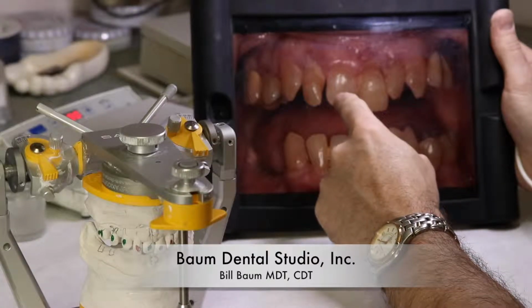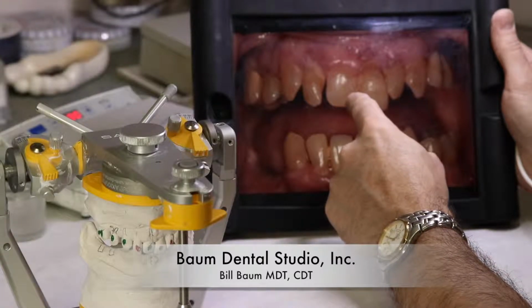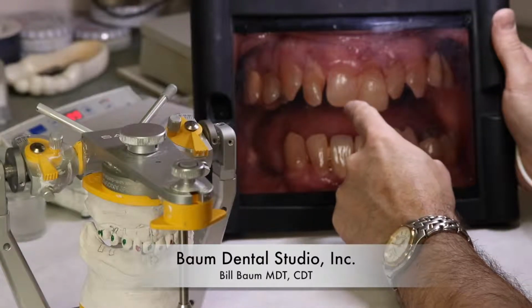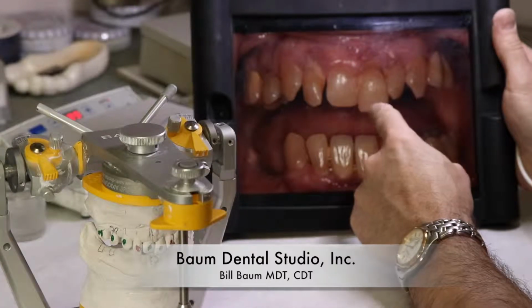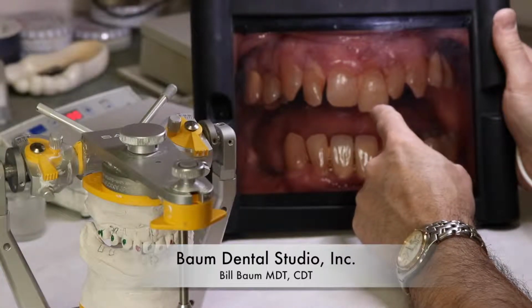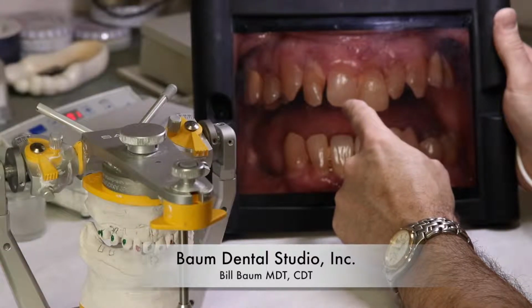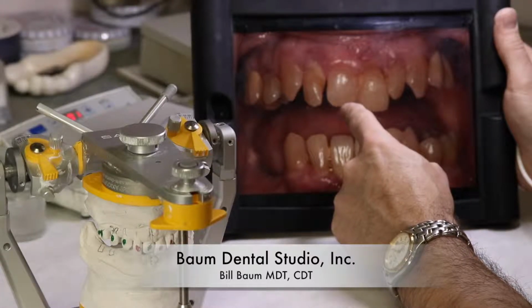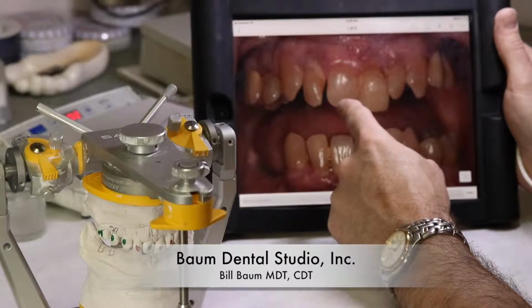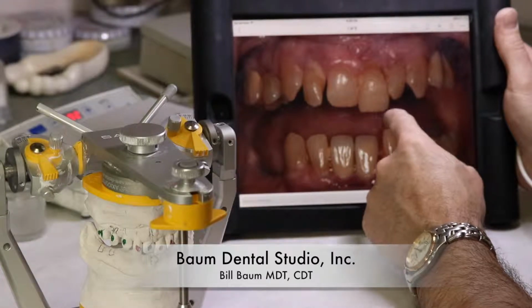As far as the incisal plane, we've determined that the incisal edge position of number 8 is at a good length. And the incisal plane of both centrals is the incisal plane we want. And the labial surface of number 8 is also approximately where we want it. So we have the labial surface, we have the incisal length, we have the incisal plane position.